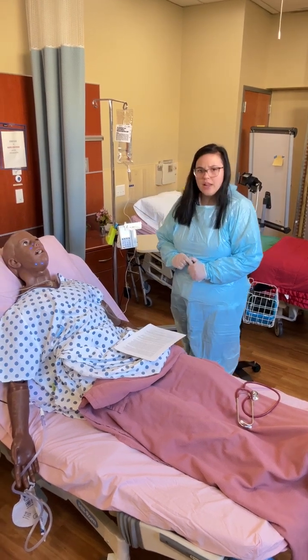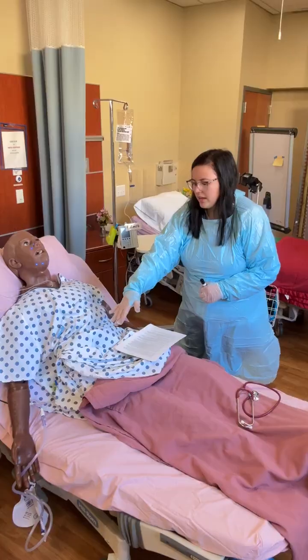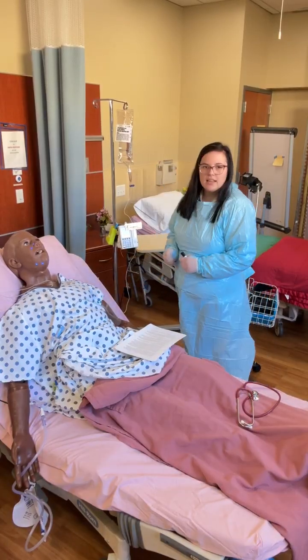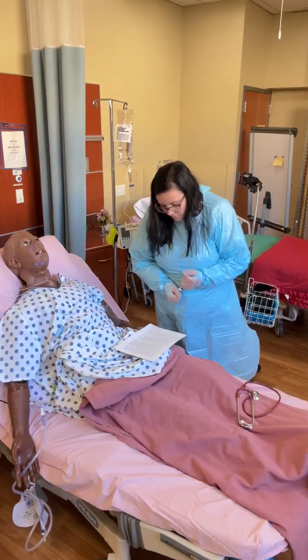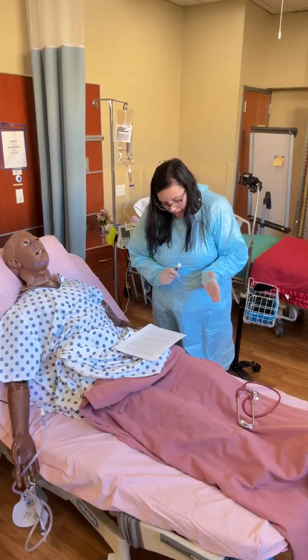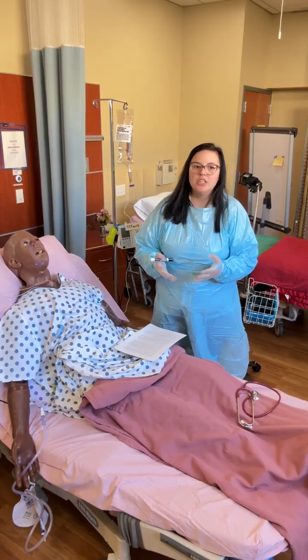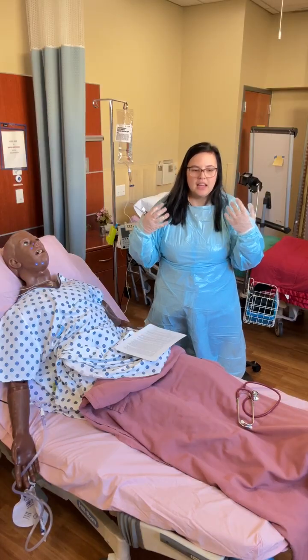Make sure you follow what you've done in skills, where you're looking at the IV site, following that tubing all the way up and assessing it throughout. We did already talk about the droplet isolation. Just make sure that you're monitoring how much you're touching your face.